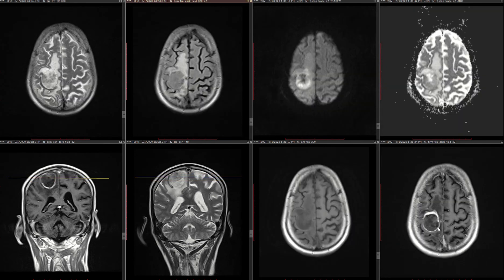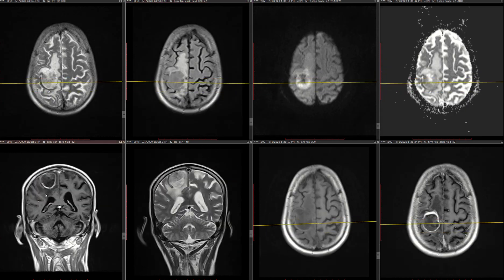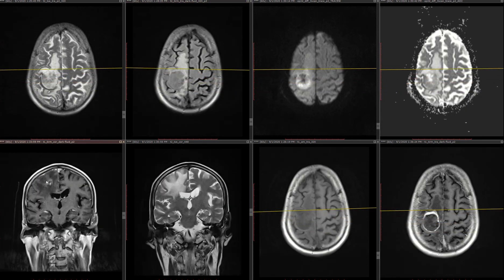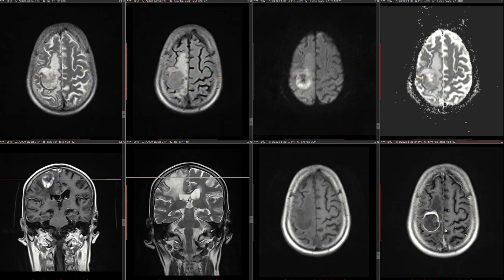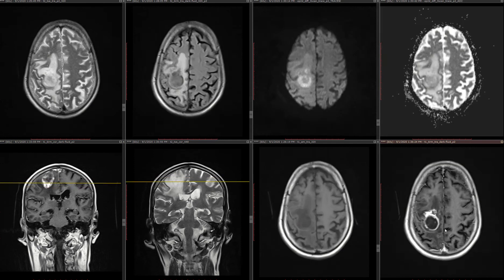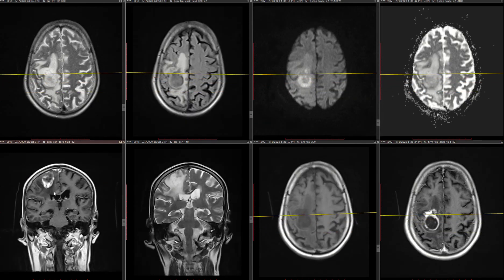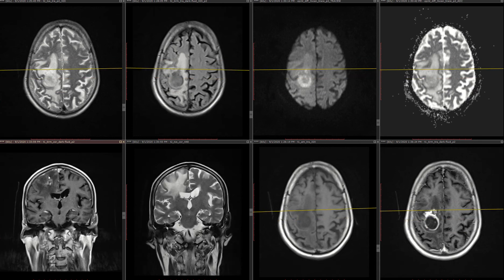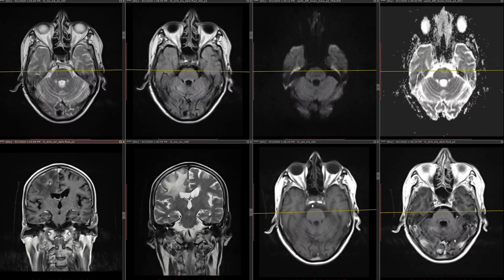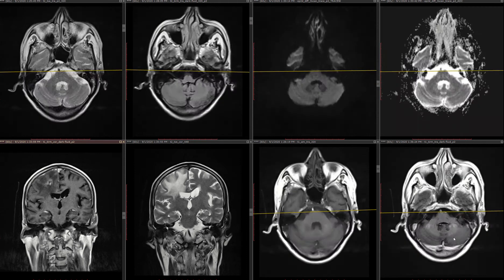On T1 post-contrast, you can see there is peripheral enhancement — a ring-like enhancement. On the coronal sections, there is a ring happening, and that ring is kind of irregular because anteriorly there is a bigger enhancement compared to posteriorly. As for meningeal enhancement, there's not much to say — not significant meningeal enhancement.